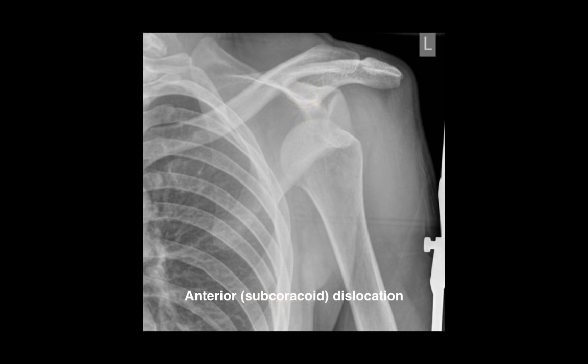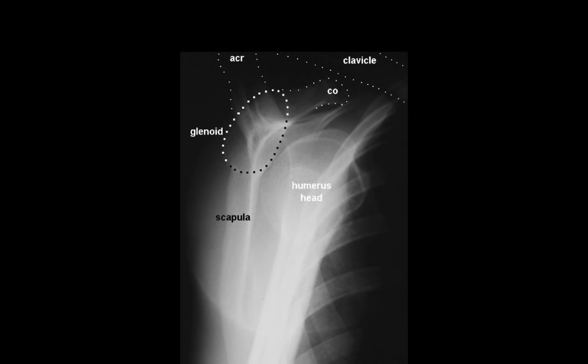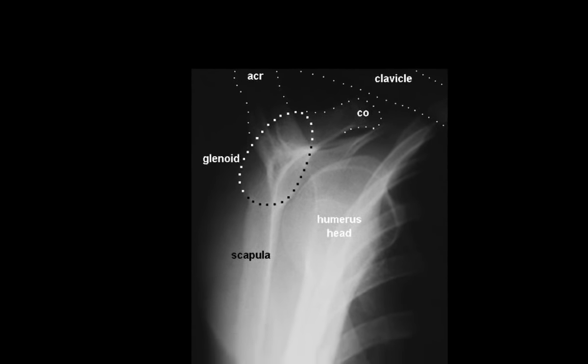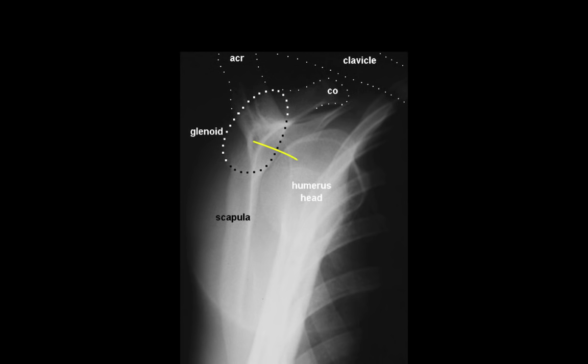Anterior dislocations comprise 95% of all dislocations. We can confirm the anterior dislocation by looking at our lateral view. Here we can see the glenoid fossa is empty. The humeral head is anterior to it, towards the ribcage.